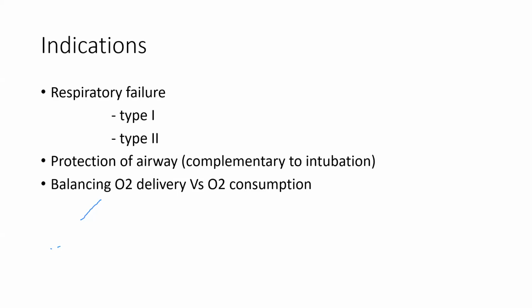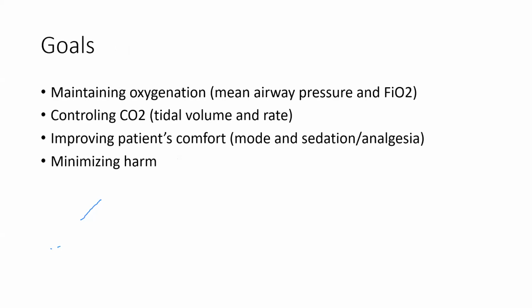Mechanical ventilation, like any medical intervention, when you are starting it, you need to set your goals. And obviously, the main goal of mechanical ventilation is controlling the ABG, but as we said, you do not necessarily want a normal ABG, you want an acceptable ABG in terms of oxygenation. And oxygenation you can manipulate through mechanical ventilation by increasing the pressure or increasing the oxygen, FiO2, the oxygen concentration.